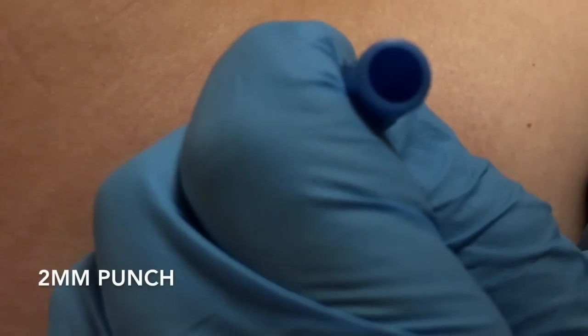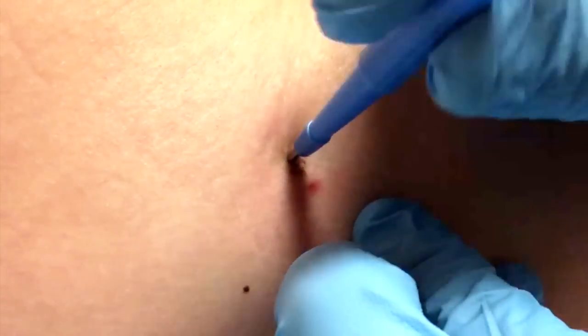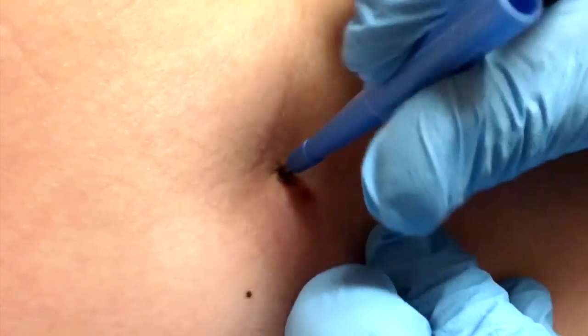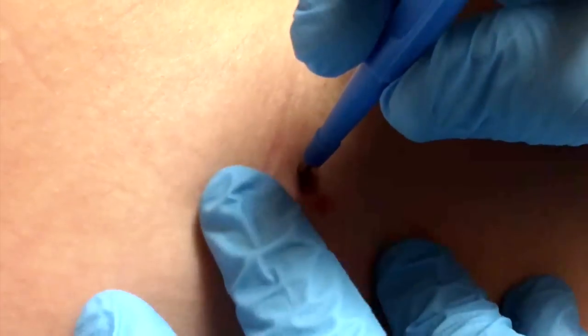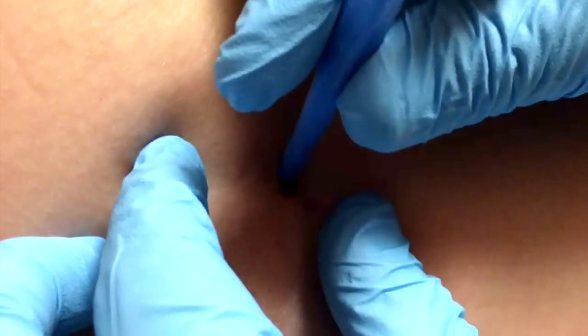You feel this? This is going to just push and make a circular cut down into the fatty tissue. There we go — you can feel it going. No pain? I feel it wiggling, but there we go.